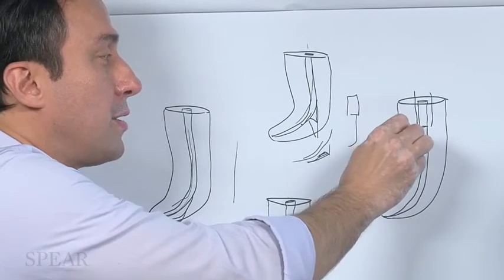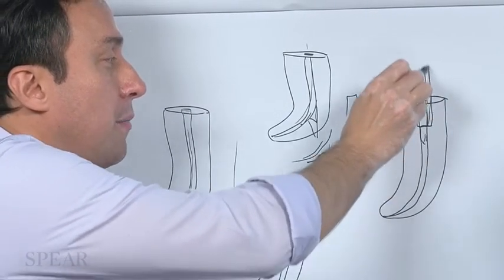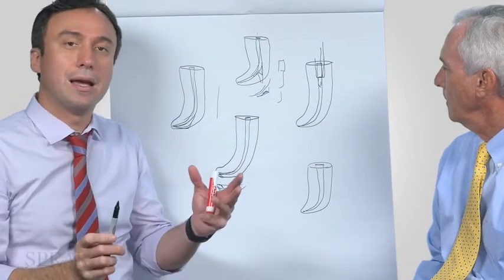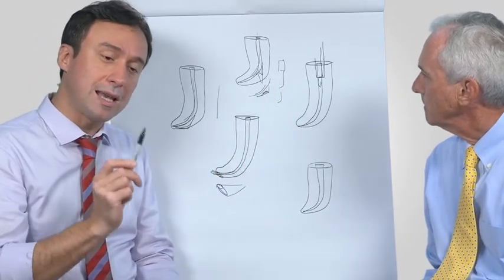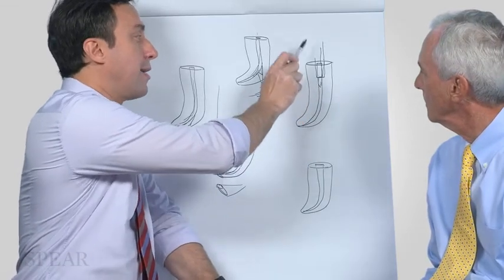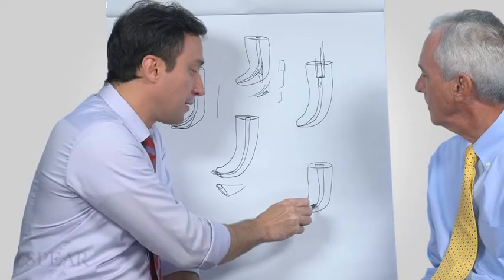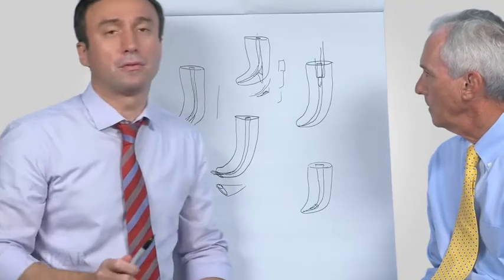They will enlarge the top enough so that you can create a platform and then use a specialized ultrasonic tip to basically engage the side of this broken file, and then almost be able to see as it unwinds and is agitated and vibrated out of there. So that's the key thing. But if files break beyond the curvature of the root, it's very difficult to remove them.